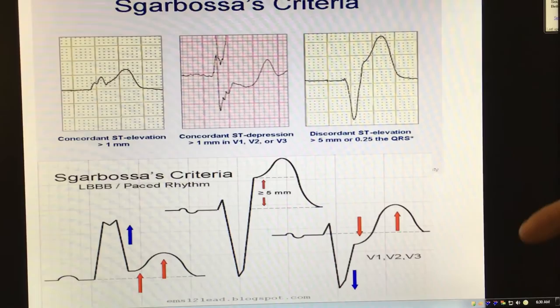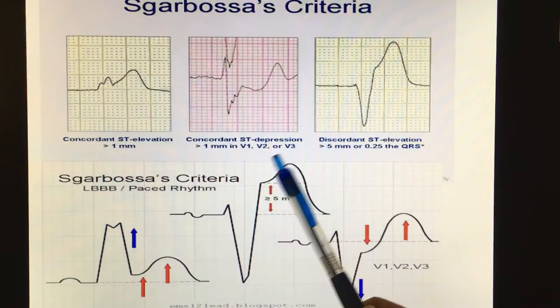Oh man, that Dylan can draw. I can't draw, so I'm going to show you some EKGs. Sgarbosa criteria — here they are in front of you.